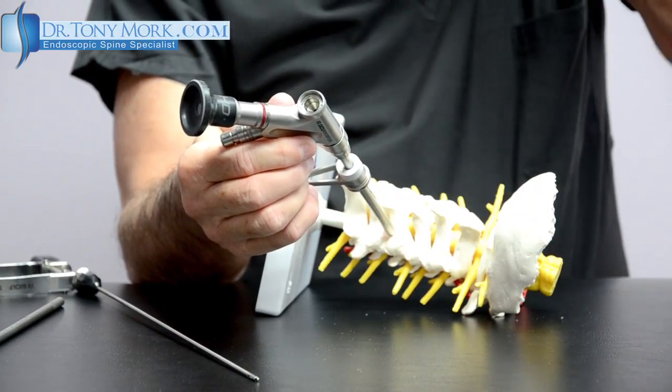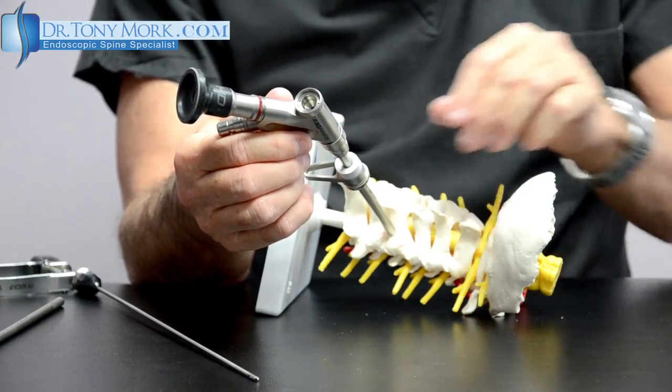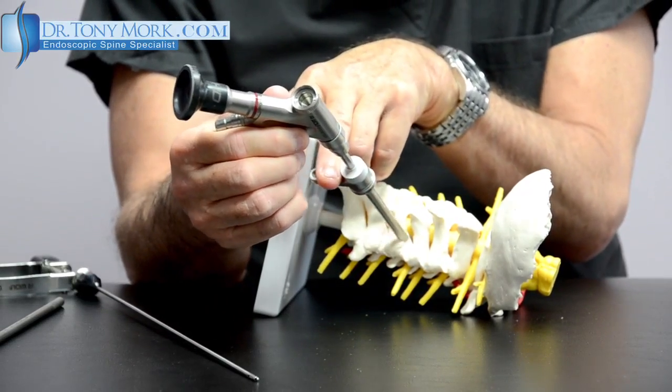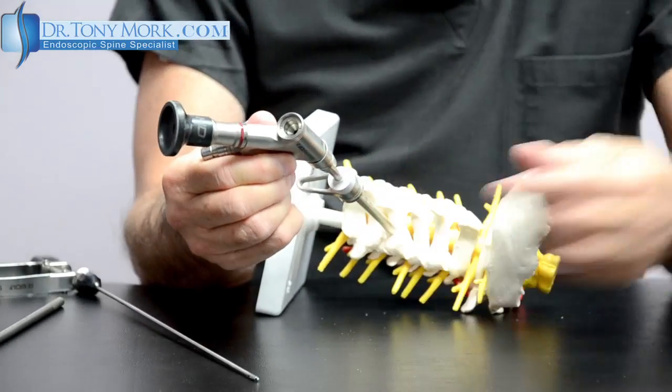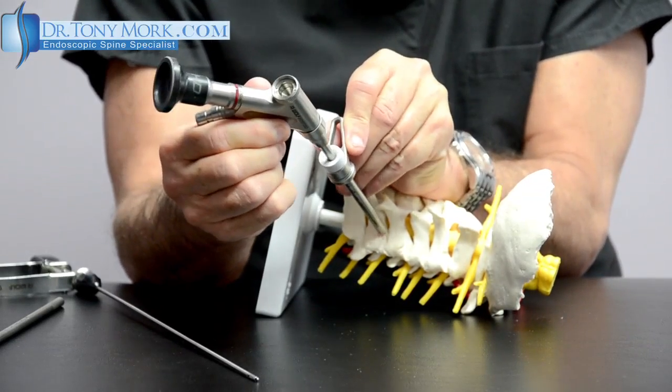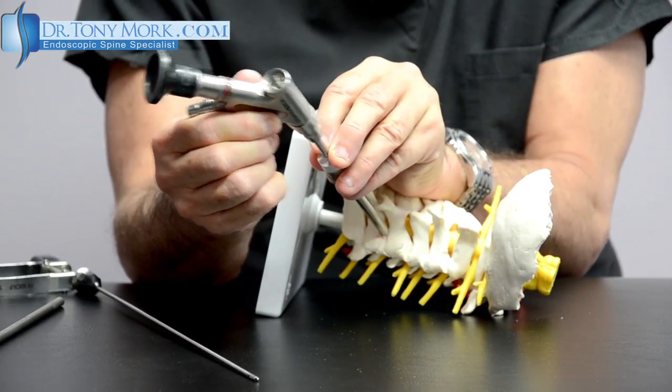This allows the port to be established, and then at this point the vertebroscope or arthroscope can be inserted down the cannula to the area of interest. You can see that we have the hollow tube established down to the area of interest, and then we have the endoscope, which is able to move in and out.